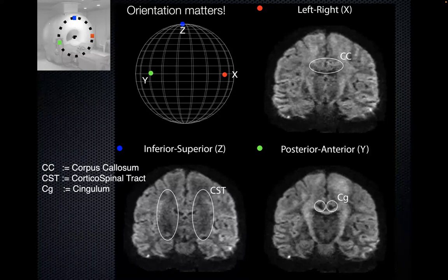It's ugly. I'll give you that. It's low resolution. It's pixelized. And you don't know anatomy here, but remember when I was saying my motor tracks come from my spinal cord all the way up to my motor cortex. Look at this. If I measure in Z, the image here is dark. This is dark. But if I measure in X, this is bright. It's the same brain. It hasn't moved in the MRI. What's moved is the direction at which I'm acquiring the images.